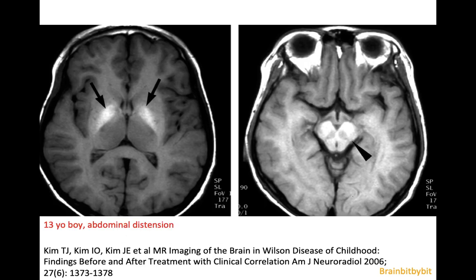Patients with Wilson's disease often present in the first decade with liver symptoms such as vomiting, jaundice, and ascites. This 13-year-old boy presented with abdominal distension, and on T1-weighted images you can see increased T1 signal in the inner part of the lentiform nucleus, the globus pallidus, and in the brainstem. This is caused by the accumulation of copper in the brain.